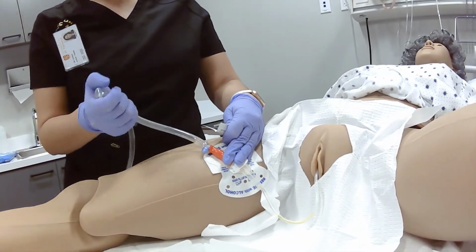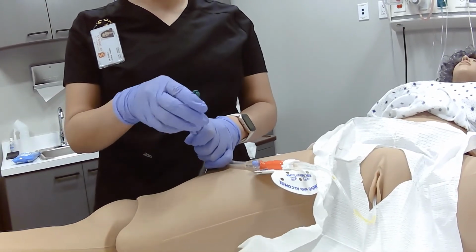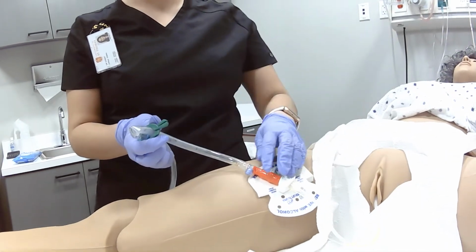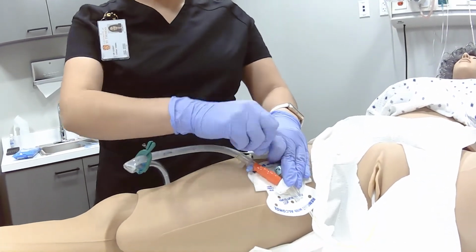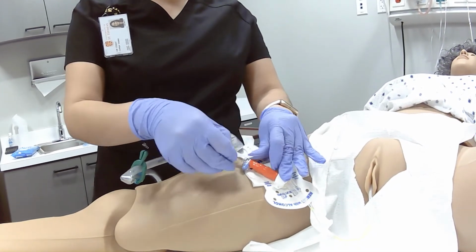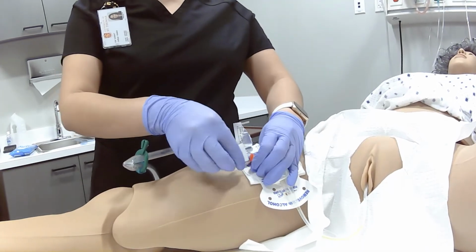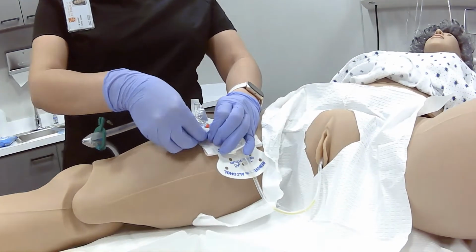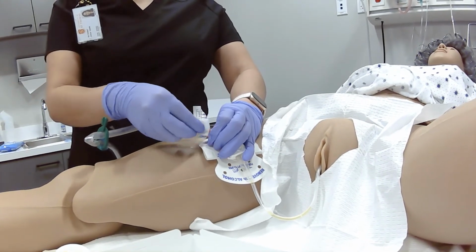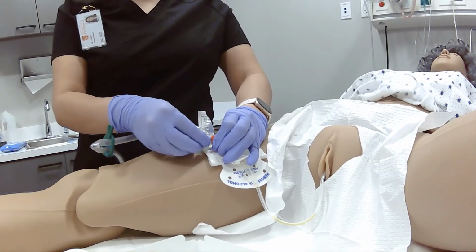You would clamp this tubing so that the urine will collect in this area. And then we would need to wipe the hub of that port for 15 to 20 seconds, because we want to make sure that all the microbes have been removed, okay? So alcohol or CHG pads, whatever your facility has.